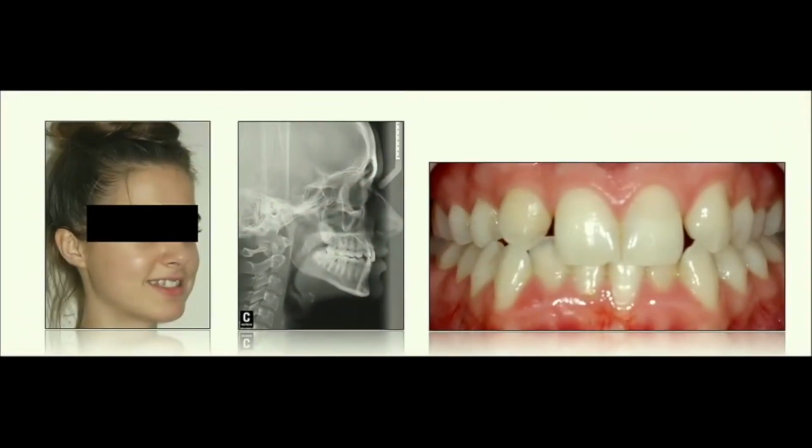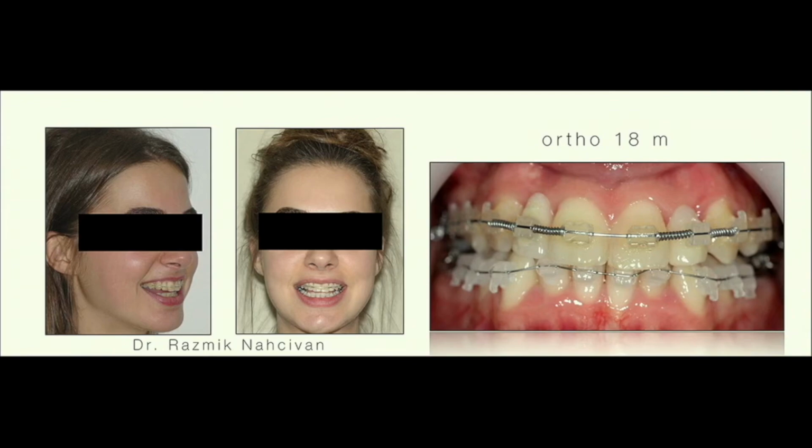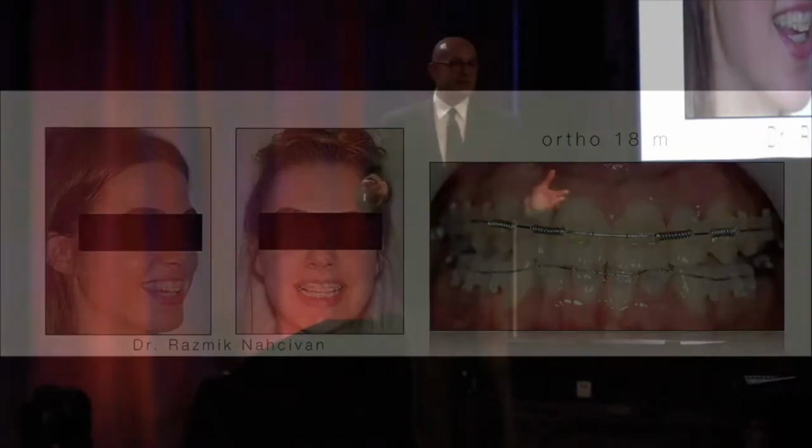Now in this case, do I use it only for simple veneer cases? Of course not. This is a case referred to us by an orthodontist, missing laterals. Thanks God he opened some space for that. We didn't have much time because the patient, who used to be a model, has been offered a great job, and we had very limited time, like 6 to 8 months.